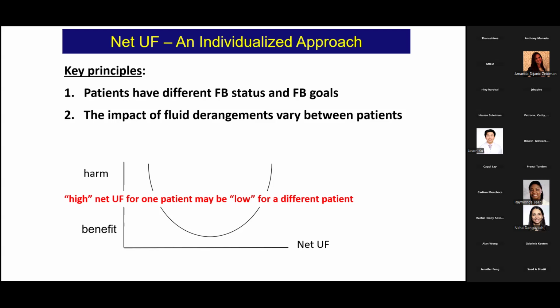And this is the part where we struggle with CRRT programs in the US in general or around the world, that we don't have enough clinical decision support tools to help us recognize, right now, of my 30 patients on CRRT in the ICU, there are three that are very off with the goal. And either I need to change the goal because that patient doesn't need fluid removal, or the patient is not tolerating fluid removal, or I need to do something to get closer to my goal, right?